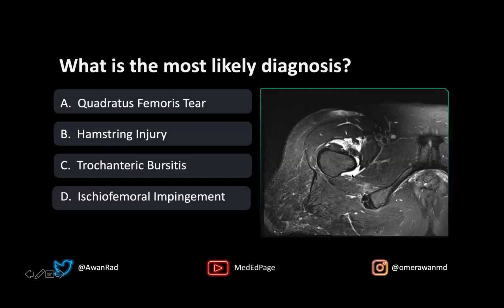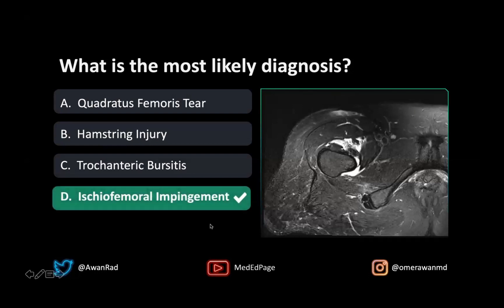The distance between the lesser trochanter and the ischiotuberosity — this here is the ischiotuberosity — is decreased compared to a normal individual. So the best answer here is ischiofemoral impingement. This occurs when there's a decreased distance between the lesser trochanter and the ischiotuberosity, and you can often get edema or even atrophy of the quadratus femoris muscle.